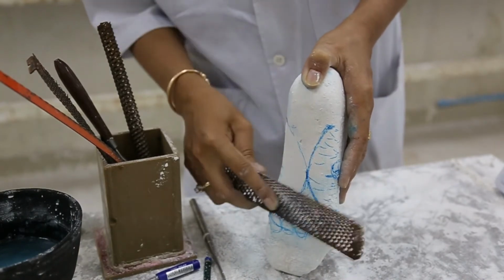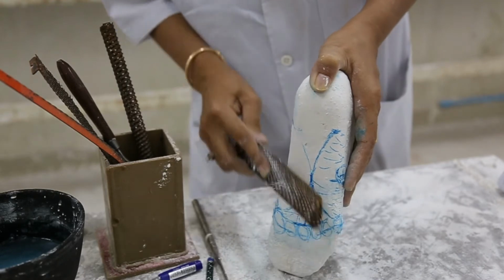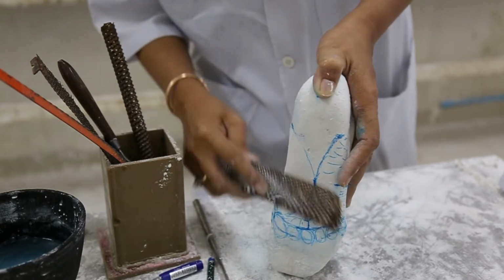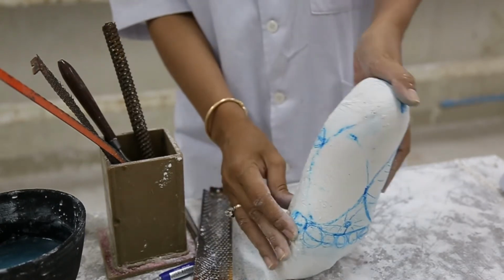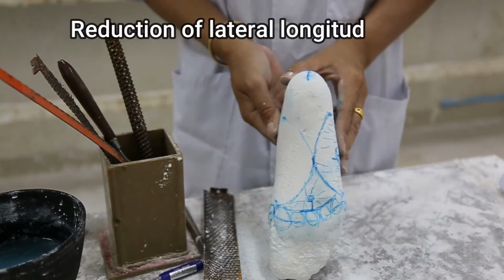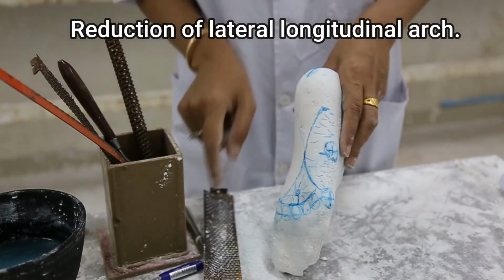So for reduction at the medial arch, as I said, you need to have a good assessment from the clients, from the side. Next, we are going to reduct at the lateral arch.